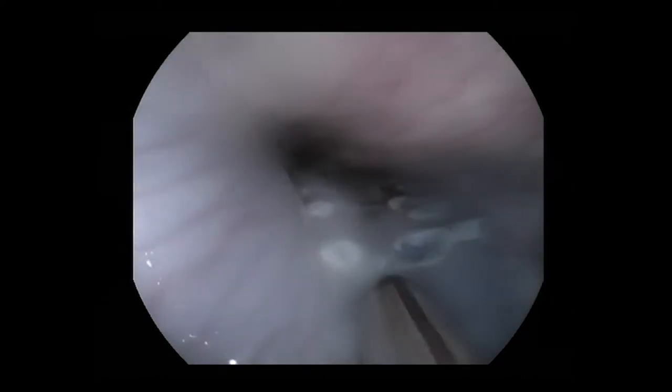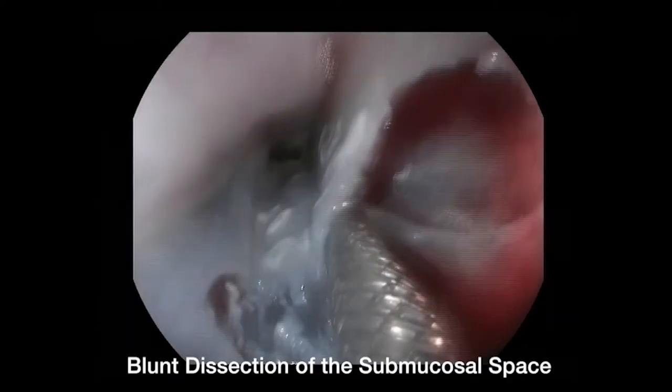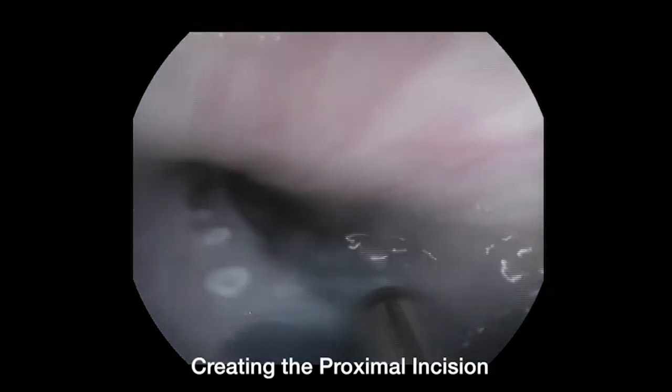Using the mechanical rotating endorotor catheter head, a proximal incision is then made into the submucosa on the margin of the lesion. In the process, the catheter sucks the mucosal segment involved into an opening in which two small rotating knives resect the mucosal segment and deposit all of the resected matter into a filter, so that all of the tissue particles can be examined histologically afterwards, including the margins.